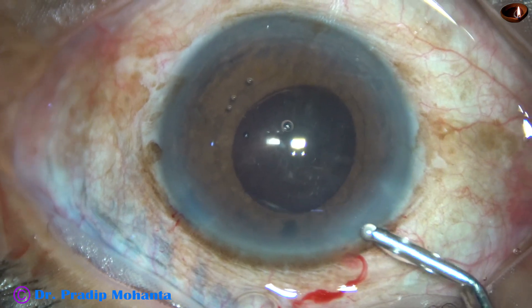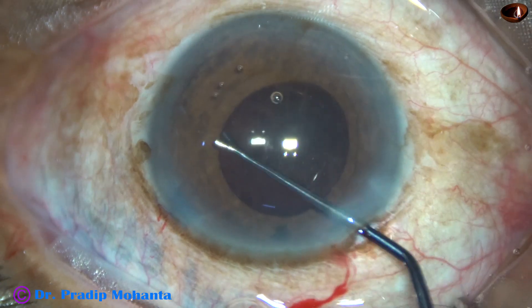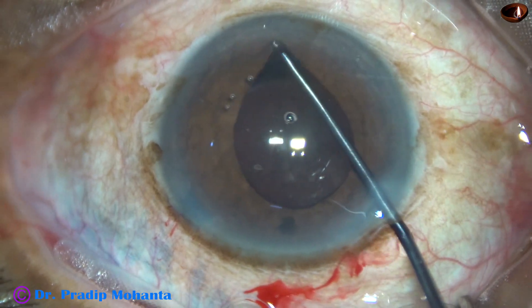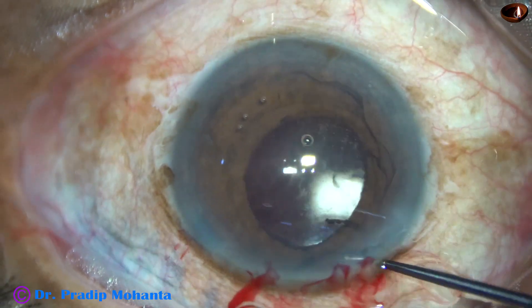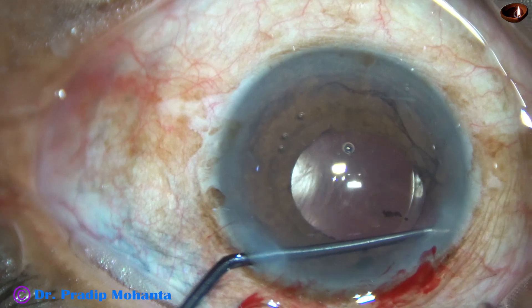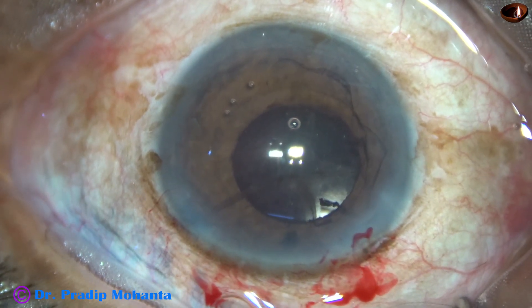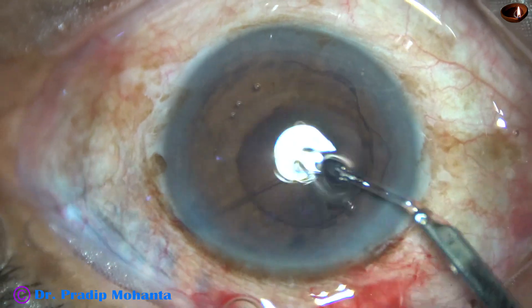And now I inject some more viscoelastic and then take this instrument, which is very useful to retract the iris all around. Sweep all around and check if there is any cortical matter anywhere behind the iris. So this is a 360-degree check of cortex.